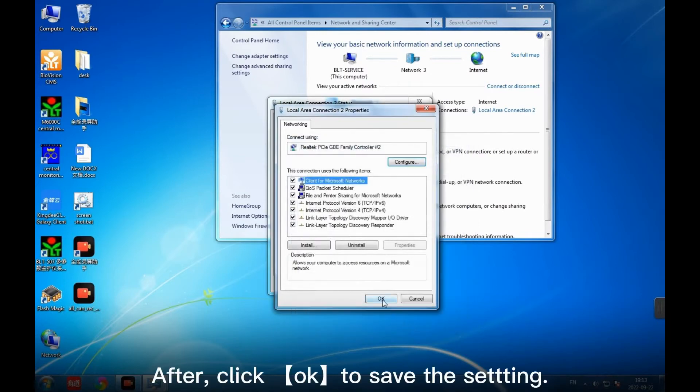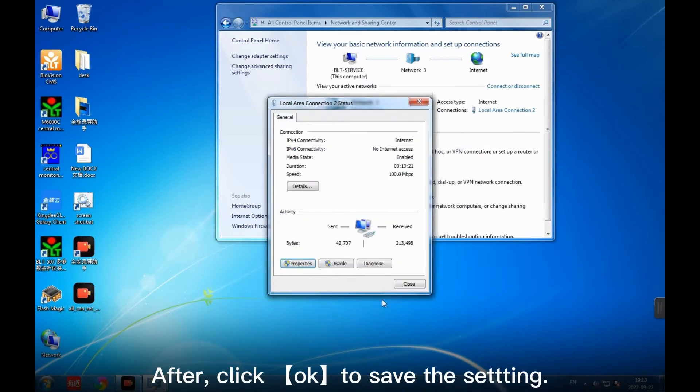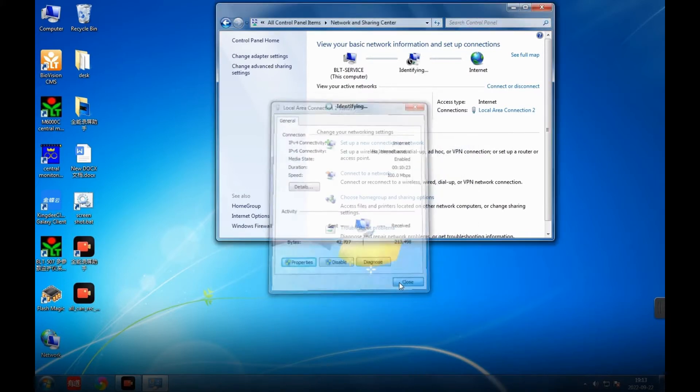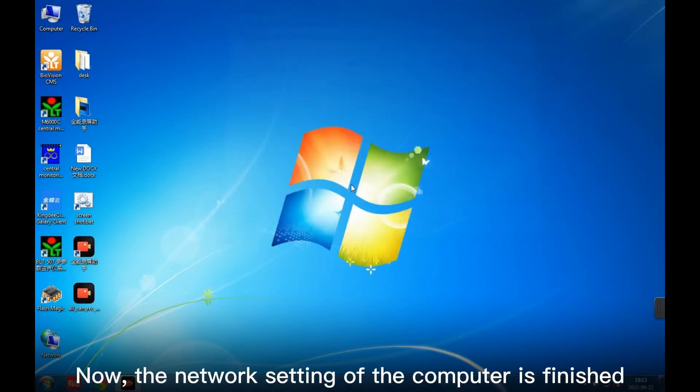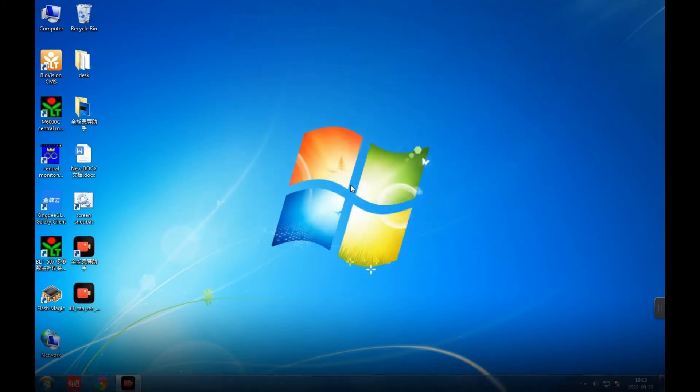After, click OK to save the setting. Now, the network setting of the computer is finished.